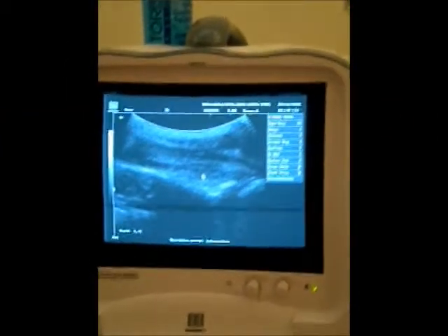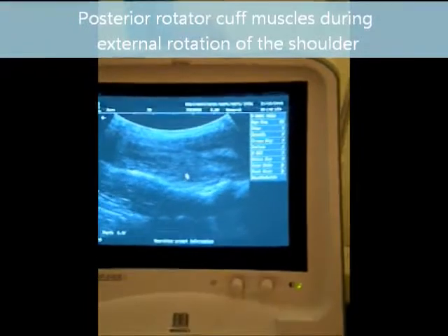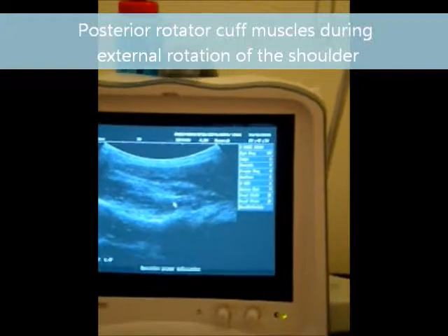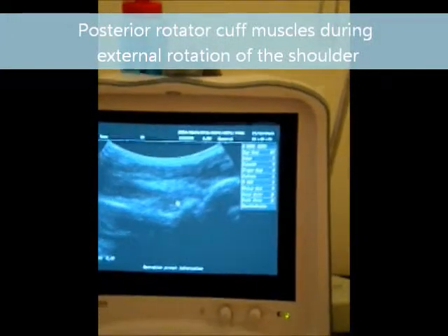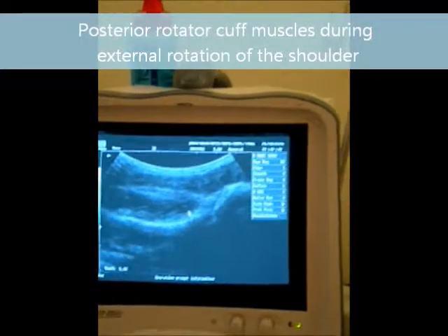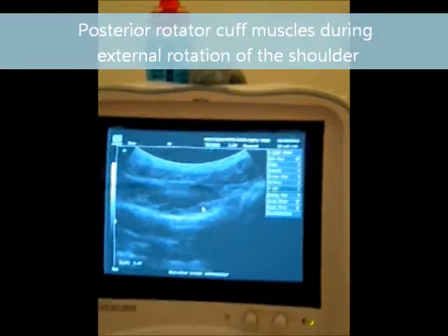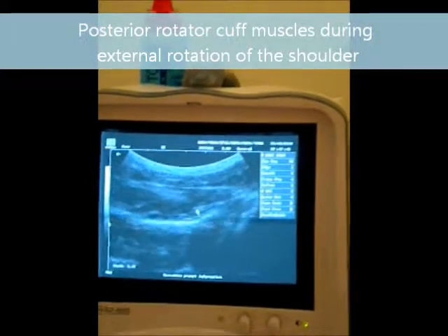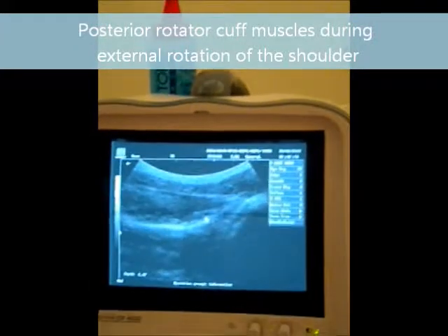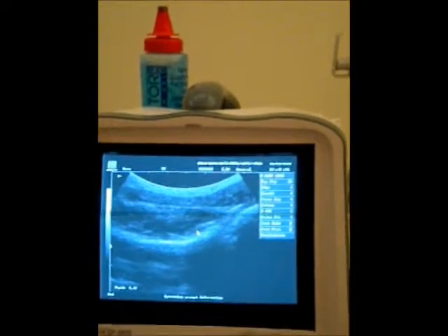Here we're looking at the back of the shoulder using real-time ultrasound. What we want to see is how those white fibres, which are the myofascia, how that is gliding on the screen. That gives us some idea of where a muscle may have spasms, where there may be a small tear. We're also looking for black spots, which could be swelling, and overall just having a look to see how those muscles glide within themselves.